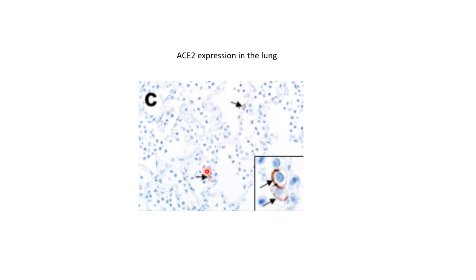When you look at it, if you imagine this is the alveolus, imagine this is a three-dimensional space, then you can see the surface of the Pneumocyte2 that is stained is the one that is pointing into the alveolar air space. So the surface pointing away from the alveolar air space is not stained. Again, the surface of the Pneumocyte2 that is pointing into the alveolar air space is actually stained for ACE2.